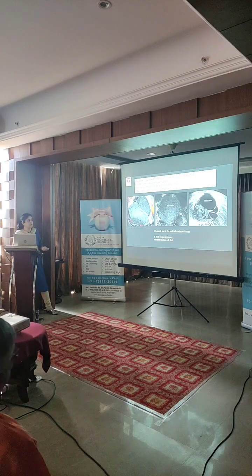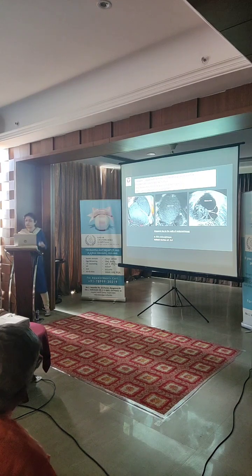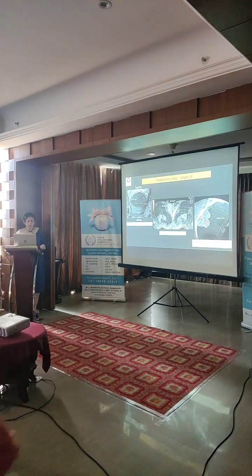And then, of course, we know the ovaries tend to be fixed. You see periovarian adhesions, loculated fluid. This is all very common. You may see the ovaries stuck. You see kissing ovaries and so on.